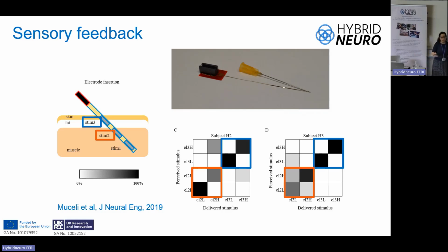Invasive measures are always invasive, right? So if you want to go for an invasive interface, you want to have surgery and have this interface only when you are very sure that it works. So if we have an electrode that we can use in acute experiments, we can insert it, and if it doesn't work, modify the design. I think this is a very important aspect because we can improve the design with many iterations until we believe that this technology is ready to be implanted. So even if there are preliminary results, I believe that they are important.